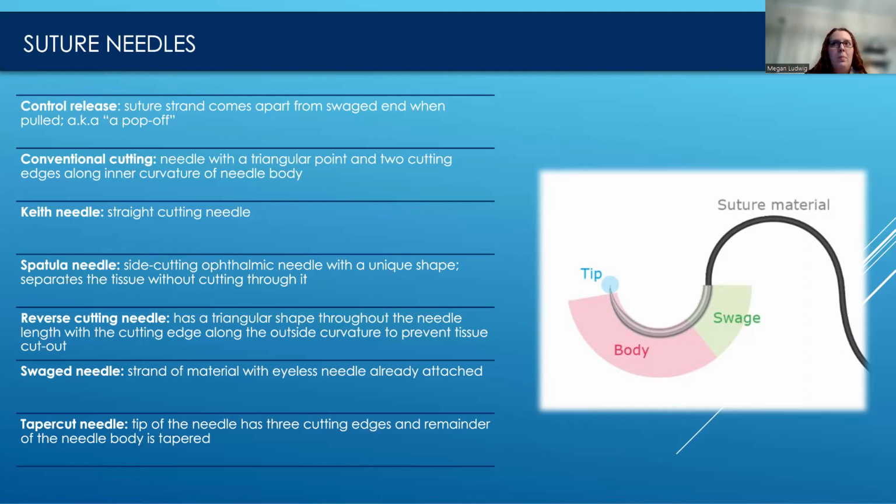Some types of wound closures require just one suture pass, like if they're going to make one swipe with that needle, tie that off and cut it. That is an interrupted suture, and they need multiple needles. So using a big pack of pop-offs can be beneficial there. You would have a suture packet with maybe 5 or 8 needles in it. Those are usually pop-offs.